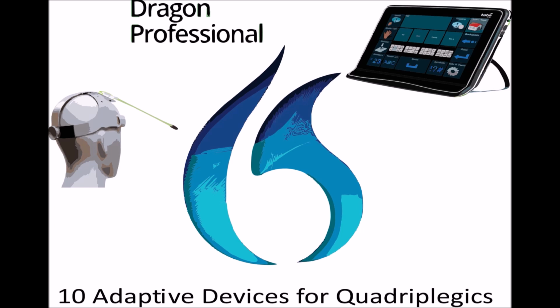Hand splints are assistive devices designed to support, immobilize, or mobilize the hand, wrist, or fingers. They are commonly used to aid in the recovery process of hand injuries or surgeries, to prevent further damage, and to improve hand function. Hand splints can be custom-made or prefabricated and come in a variety of shapes, sizes, and materials, including plastic, metal, or fabric. They can be used for various conditions, including arthritis, carpal tunnel syndrome, stroke, and nerve damage.